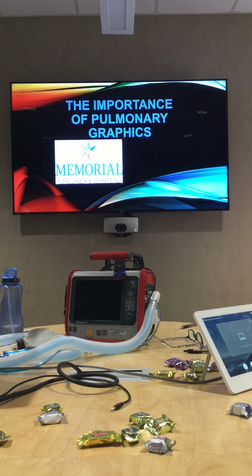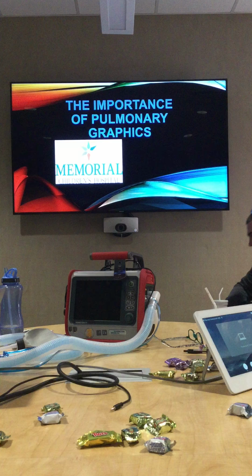Right. So I know that most of us aren't used to looking at these things on a normal basis, unless you're used to doing graphics. Some of these graphics are actually available on the Hamilton, which we'll get into. So what do you think the importance of monitoring graphics is? They actually tell you a little bit more about your patient before you even get started.